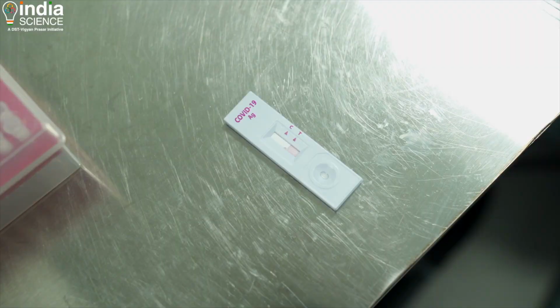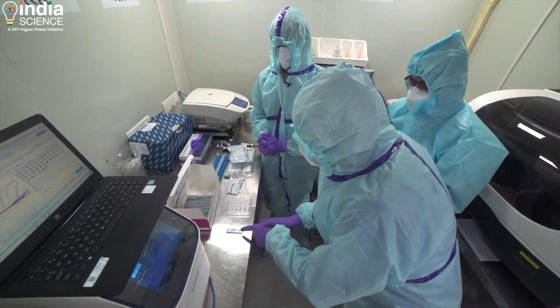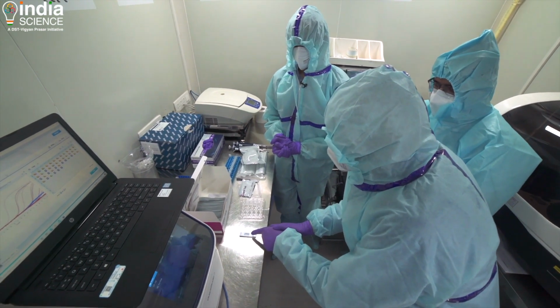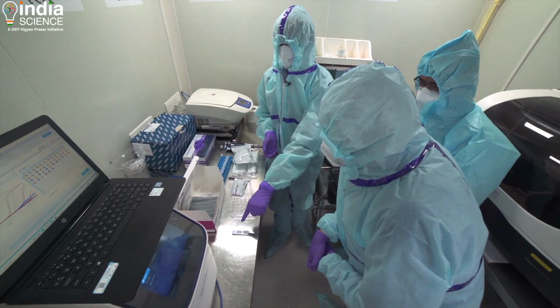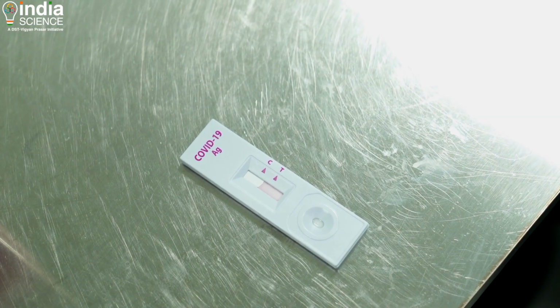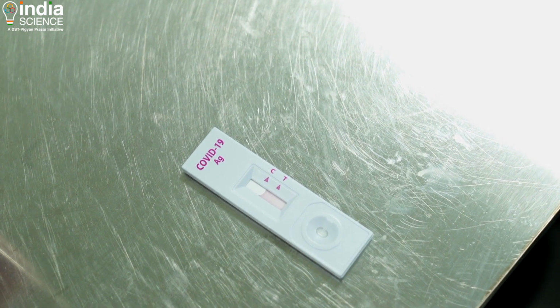So the control sample always lights up, showing that your kit is working fine. If the test sample lights up, you are positive. If it is negative, you will not see a line at T. You will see, when the line develops at control, a small streak or a band, which suggests that the kit is working fine.